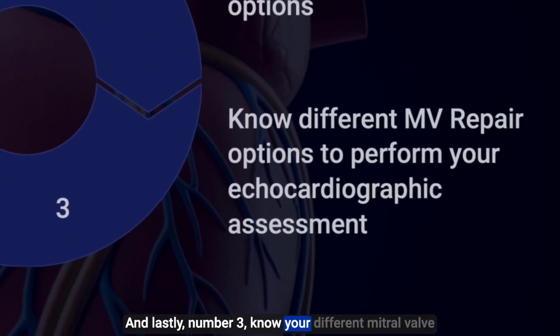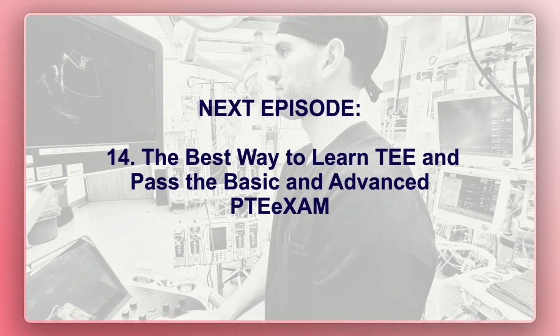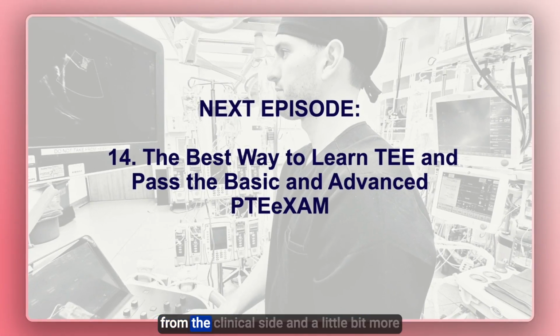And lastly, number 3, know your different mitral valve repair options, as these can inform and look different on your echocardiographic assessment post-bypass.